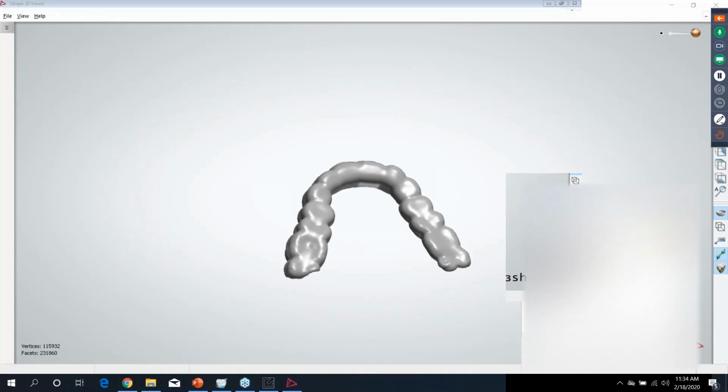So just to reiterate, this FDA clearance, this 510K clearance for a Class 2 medical device is kind of enveloped and encased in an ecosystem. So if you take our resin, which is technically 510K, into another printer, which might also be 510K, but those don't fall under the same ecosystem, you have not manufactured a 510K cleared device.